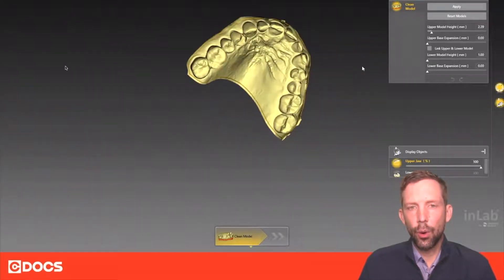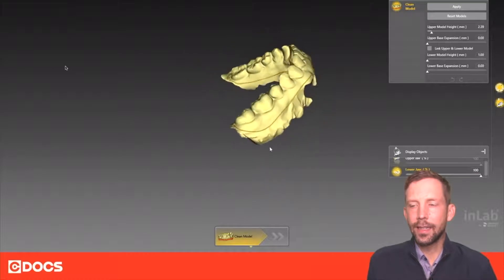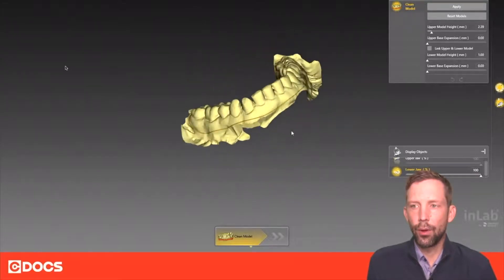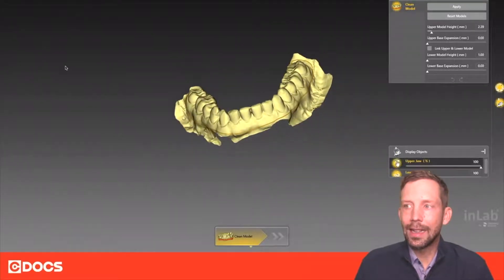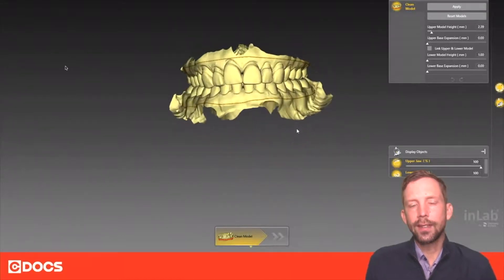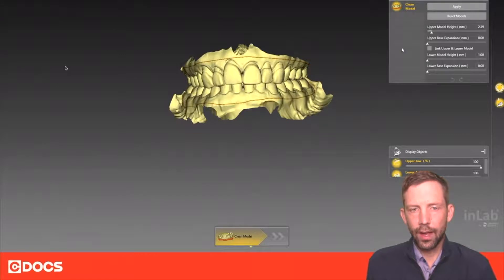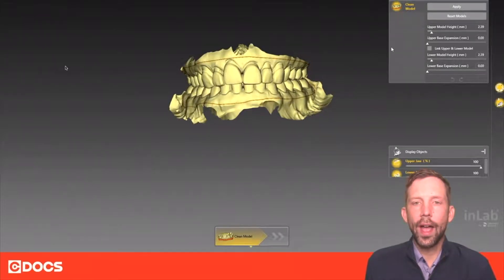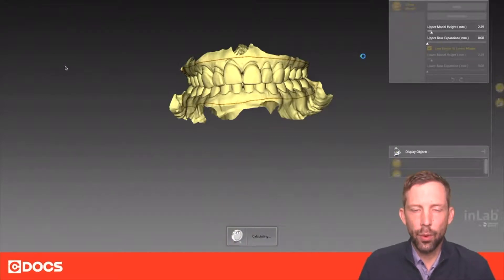I also did this for the lower arch. You can see that they're both together. We can go ahead at the top and link the upper and lower models together so when we process the bases of these models they're going to be done together. We'll go ahead and hit apply, and then you're going to see the bases come up very quickly.